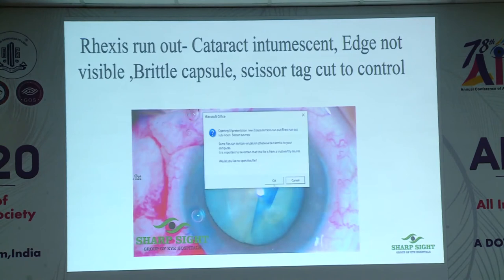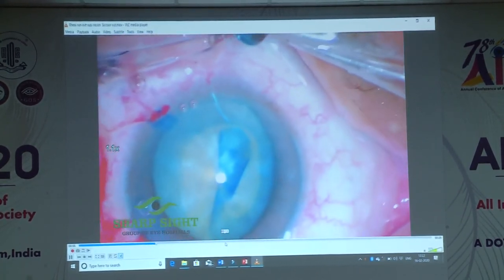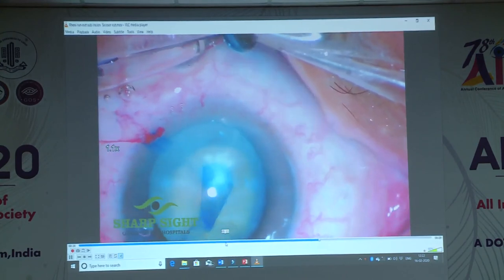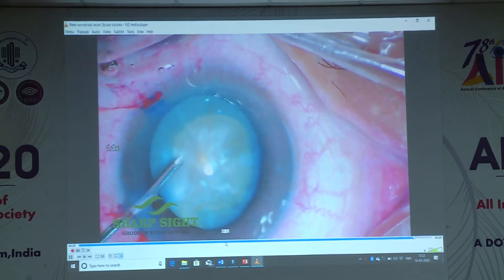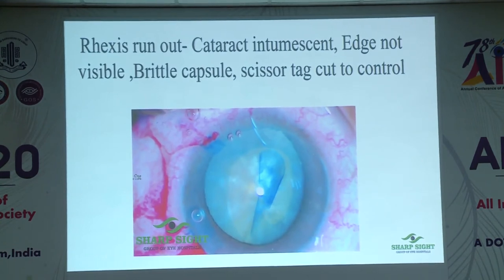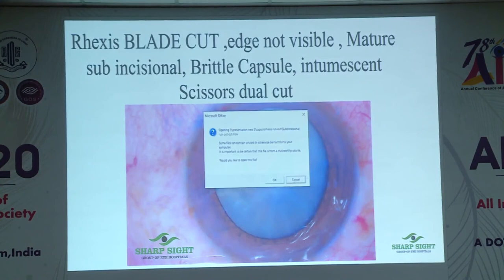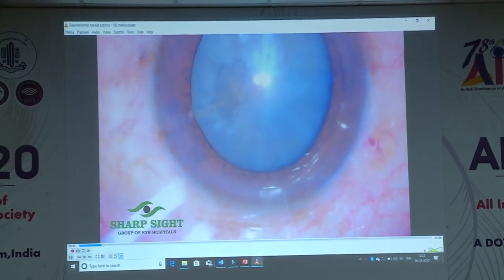Another case: rhexis runout with high intralenticular pressure — completely gone to the periphery. The trick is to round off that tag because it will bother you. Now I have a sharp edge, but since I am the one operating I know what pressures to maintain in the anterior chamber. If you push in too much viscoelastic, you will again extend it. Don't increase the bottle height in this situation. Avoid going in and out repeatedly, because the shallowing and deepening of the chamber will extend the V-tear. Once you go in, finish the surgery and come out once. Then this next interesting situation: it was a topical surgery, I made the port, and the blade went inside the eye, cutting straight — creating two flaps with tear into the intralenticular pressure zone.